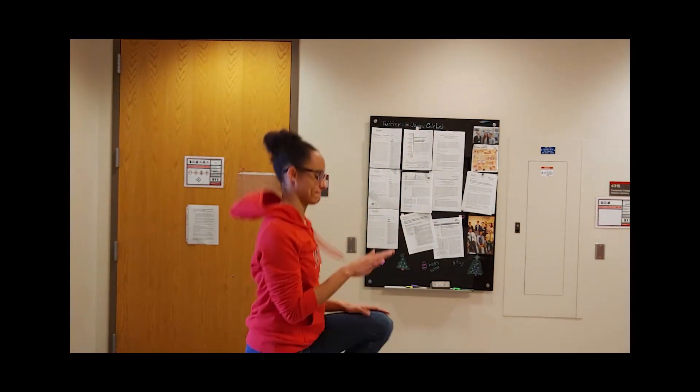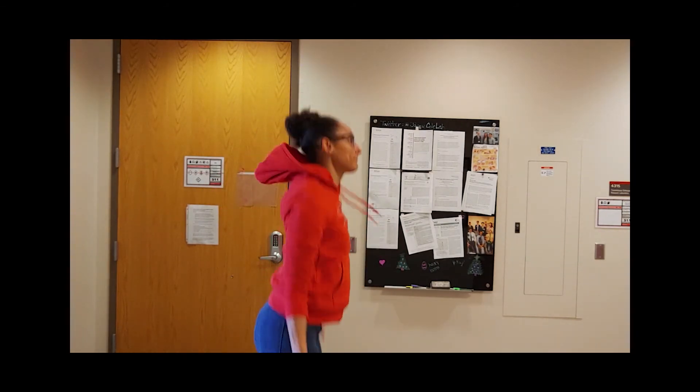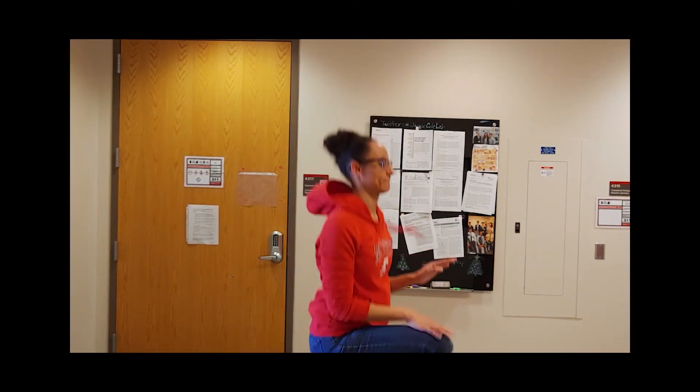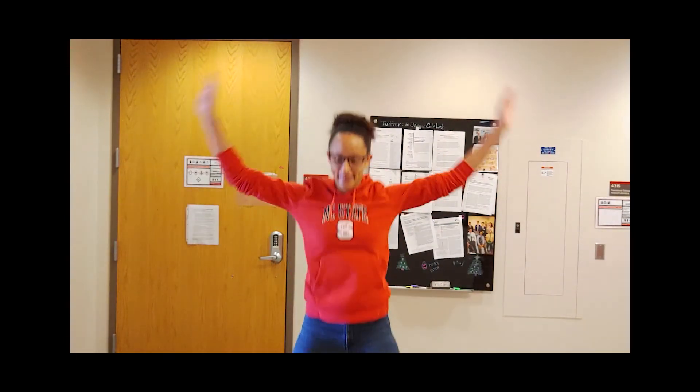Our volunteer was asked to do a quick set of exercises to get their heart rate elevated. These exercises lasted about a minute, but are sped up here to save time.